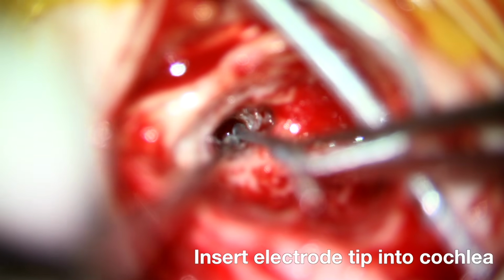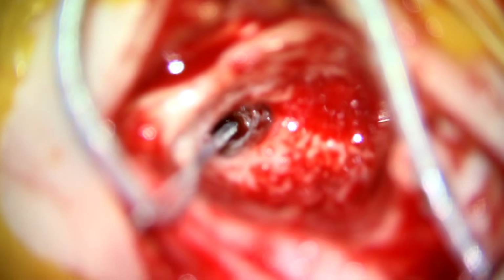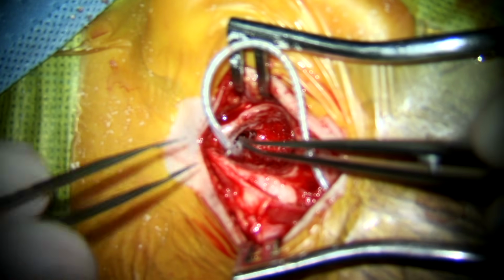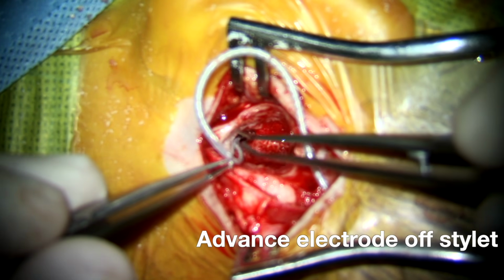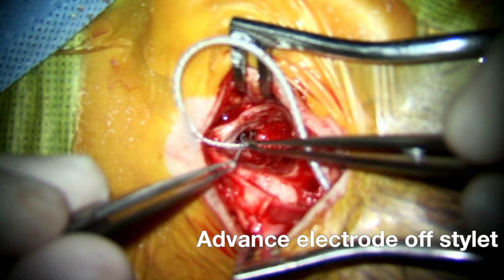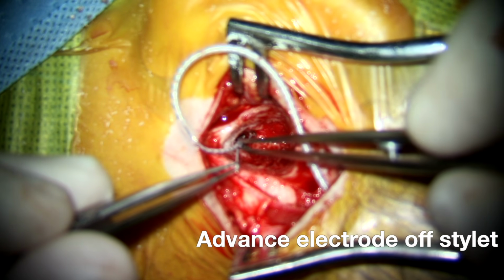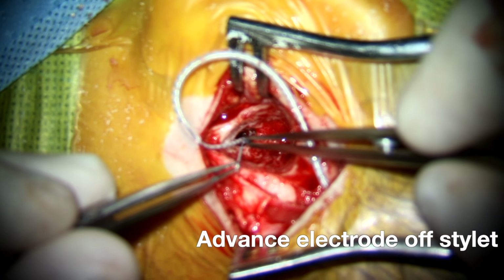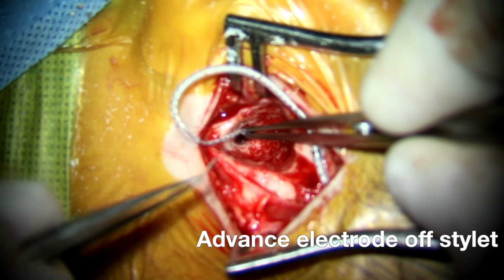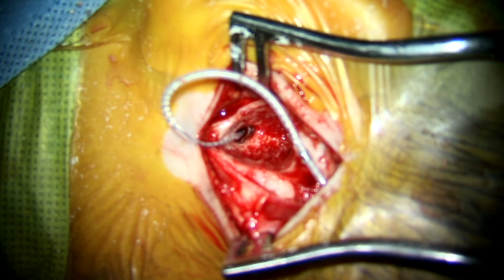This is the Advanced Bionics mid-scala electrode. So the surgeon inserted until the first blue line was at the round window, and then gently released the implant in order to reorient their hands. Now it's time to advance the electrode off stylet. So the surgeon grips the stylet with their left hand and the implant with the right hand. Holding the left hand steady, they push with their right hand for a full insertion until the second blue line reaches the round window. The blue lines are somewhat hard to appreciate on the recording of the microscope.